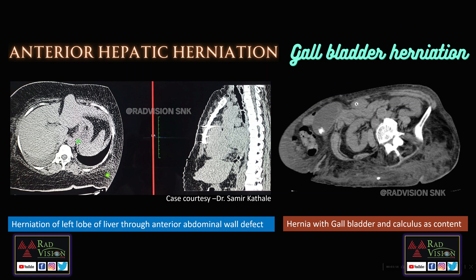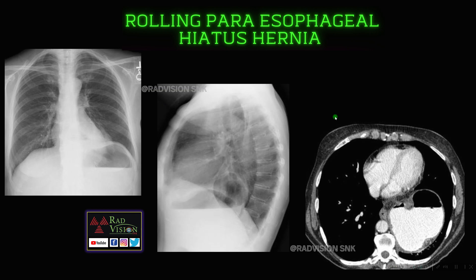Next, here you can see herniation of the left lobe of the liver into the anterior abdominal wall defect — this is anterior hepatic herniation. Thanks to Dr. Samir Kathale for contributing this case. Here also you can see there is an abdominal wall defect with herniation of the gallbladder with calculus into the subcutaneous tissues — this is called gallbladder herniation.